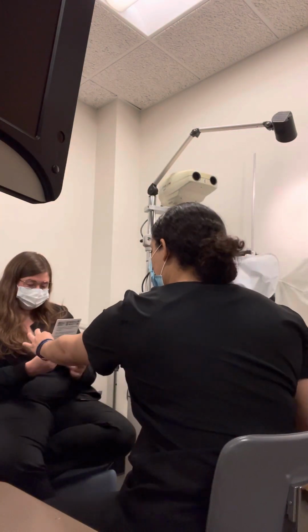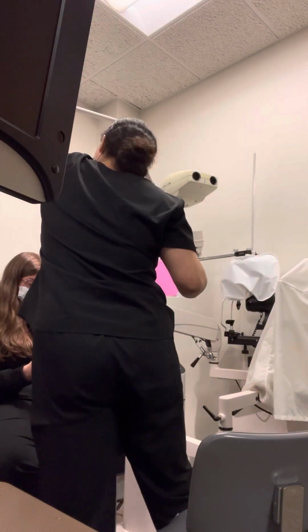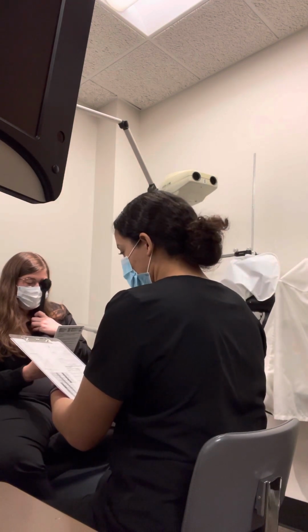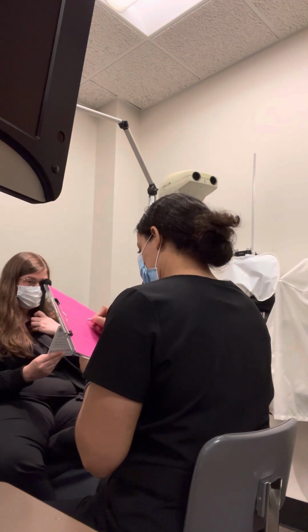Okay, next we're just going to be checking your near vision with your glasses on. So go ahead and hold that at about a comfortable reading distance. Okay, go ahead and cover up your left eye for me. Okay, and without squinting, what is the lowest line you can read for me? DLNGYS. Awesome, thank you. And do you see the glare in it?